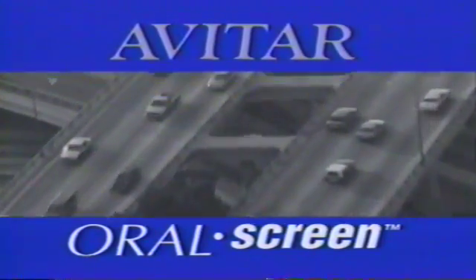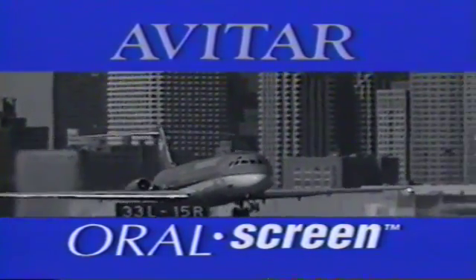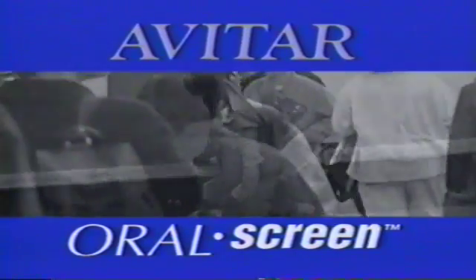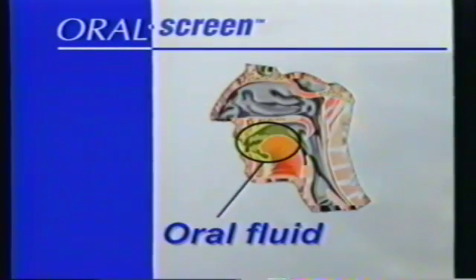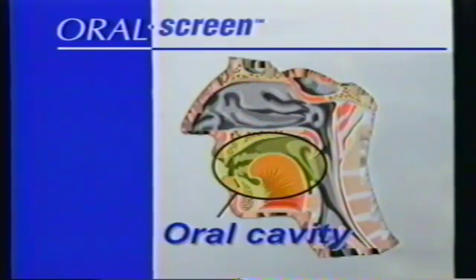You've joined thousands of other businesses and institutions that are taking a unique approach to the delicate issue of drug testing. This innovative product is the world's first rapid test for drugs of abuse using oral fluid. So what do we mean by oral fluid? Oral fluid is a combination of saliva and other fluids present in the oral cavity. The oral screen system utilizes this fluid to analyze the concentration of drugs traveling in the circulatory system, as well as any residual drug present in the oral cavity.